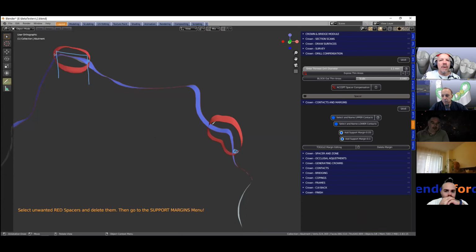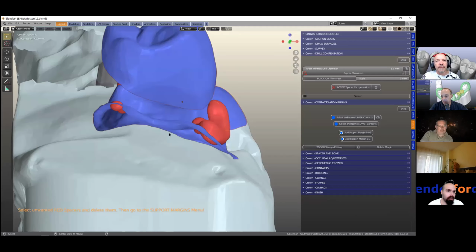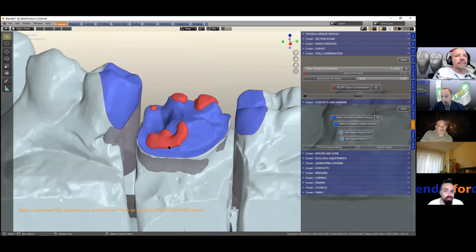Have you got any experience on this, Lorenzo? Are you there? Yep. I have always used 5-axis milling machines, so I don't know exactly how to avoid any kind of problem like this on 4-axis. By the way, I think that by a good survey of undercuts, we should avoid most of the big problems. I think so. I think so too.